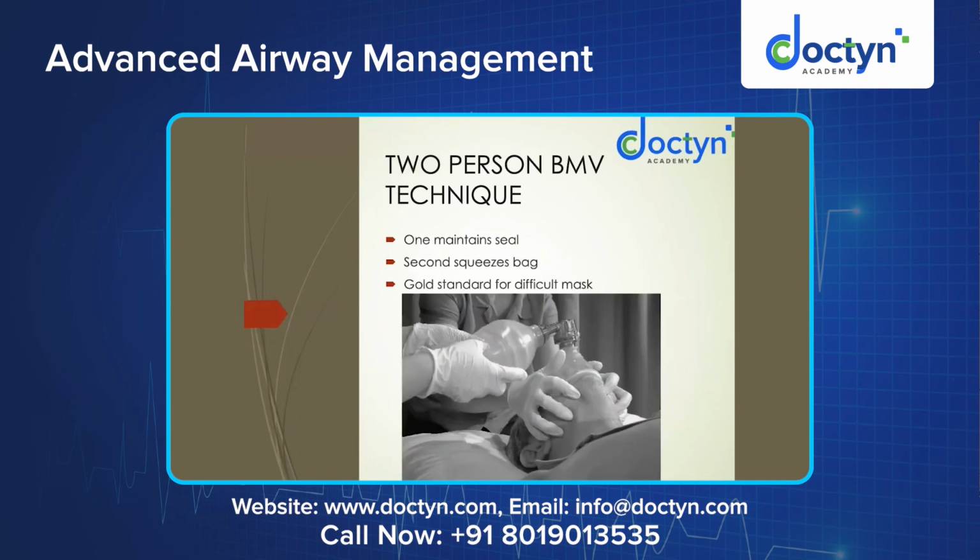In the same way, there is two-person BMV. In an obese patient or a heavy-jawed patient, or if there is some bleeding, you need more support. So you can call for one more person to help you press the bag. The self-inflating bag of the AMBU will be pressed by the other person, and the mask sealing will be done by the first person using two hands, and there will be no CE.